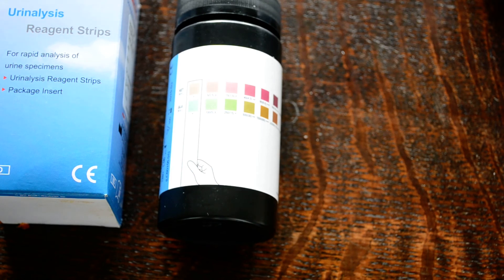So that's the Mission URS 2K glucose and ketones urine dip test. I hope this advice has been useful for you.